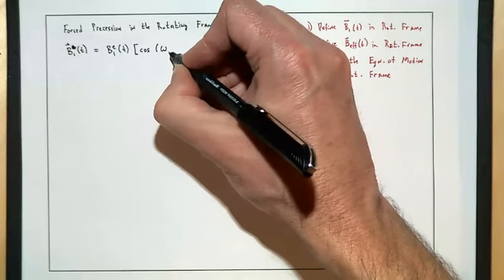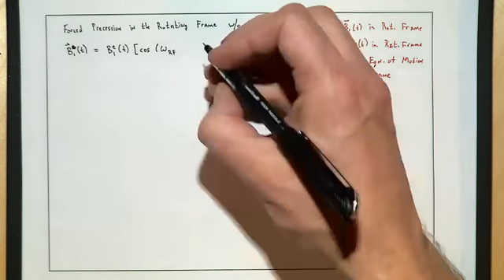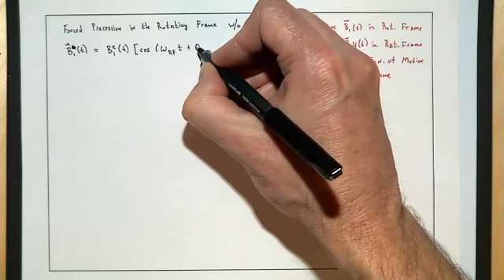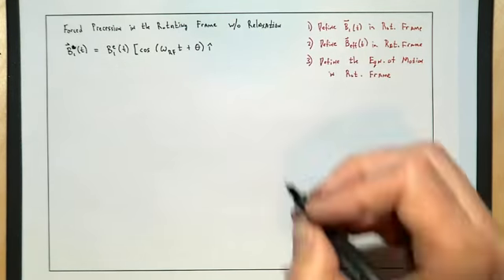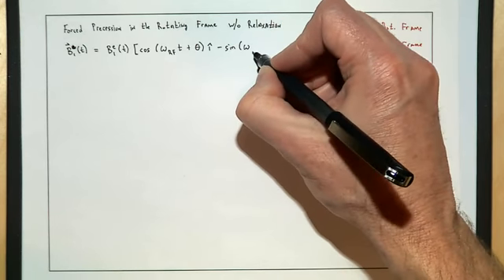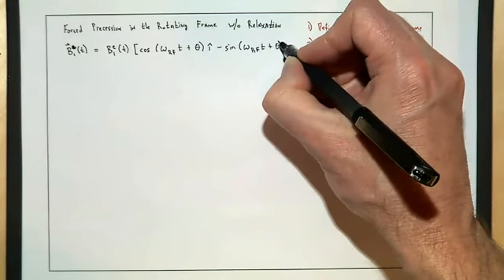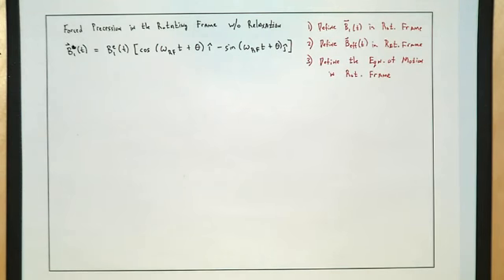The cosine had radio frequency energy at the RF frequency of interest times time, and we could, in theory, add some phase to that, and that would oscillate back and forth along the i direction. And then we also had a sine term. So that was just the definition of a possible B1 field that we would use, a circularly polarized B1 field.